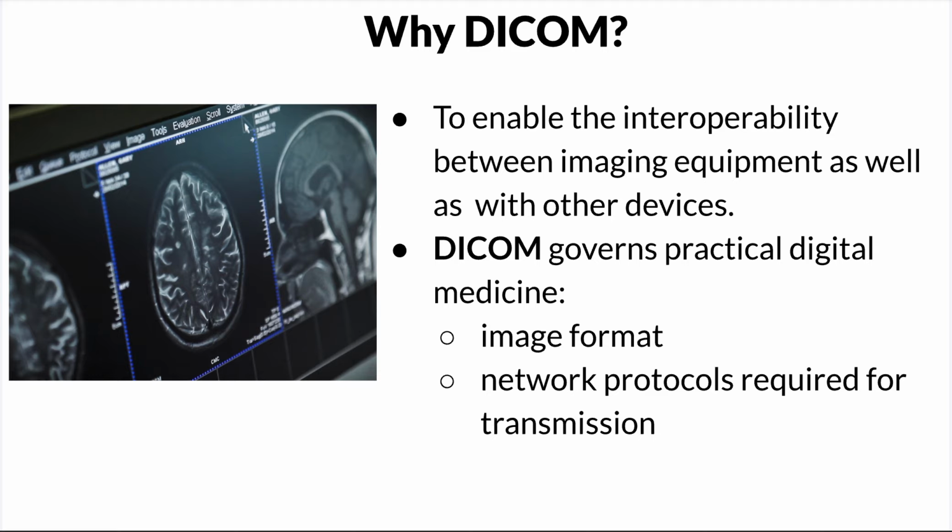All right, so why DICOM? Why do we need it? One, it enables interoperability between imaging equipment as well as other devices. If you are sharing a file between the different modalities, there's a way we can allow them to communicate, and we need a protocol, a rule, to do that. That is where DICOM comes in.